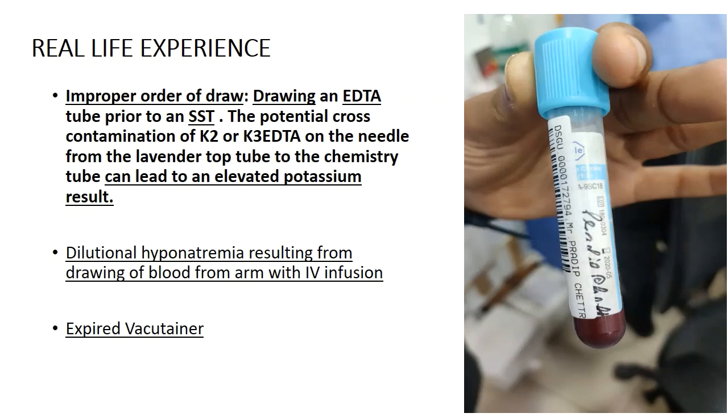loses its efficacy and the purpose will not be served. So never use an expired vacutainer. It should always be checked by the inventory audit system whether any expired vacutainer is found inside the collection.